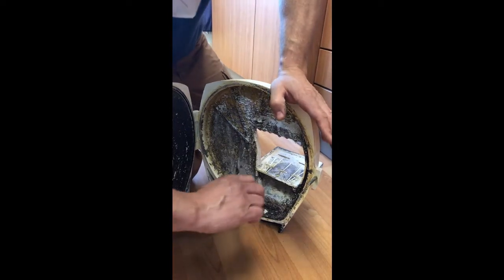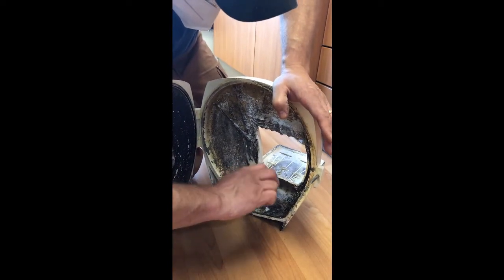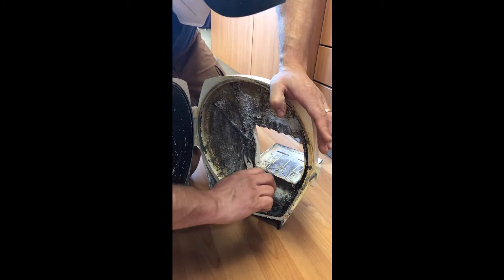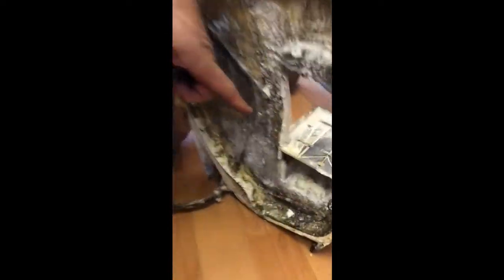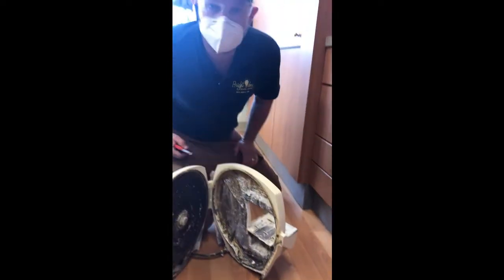Okay, now what we're going to do is take our pliers and make a little bit of a bend, and we're just going to break it along that cut line. So we're just going to take it and twist it, and we're going to expose the end. If you look, right there is a hole in the end. Now we'll be able to clean it from the top down.